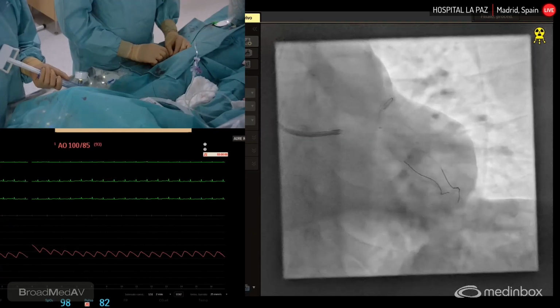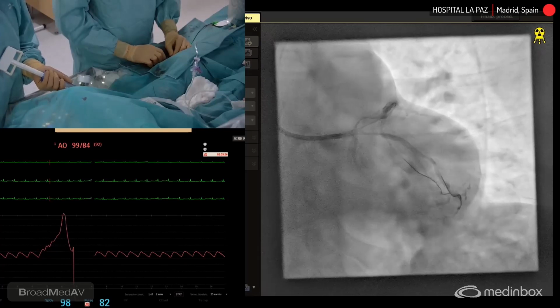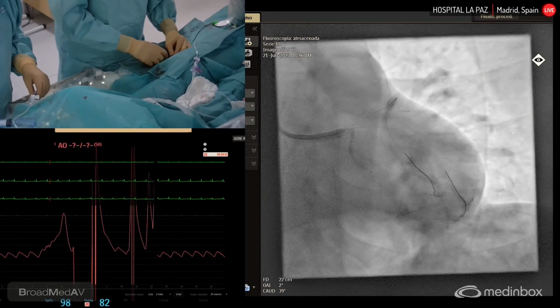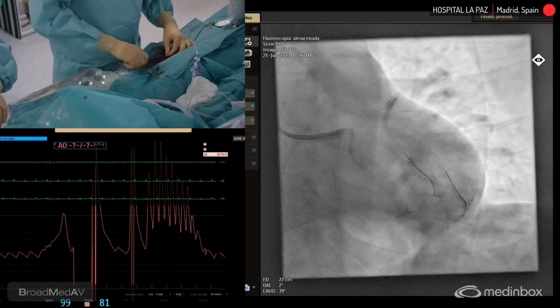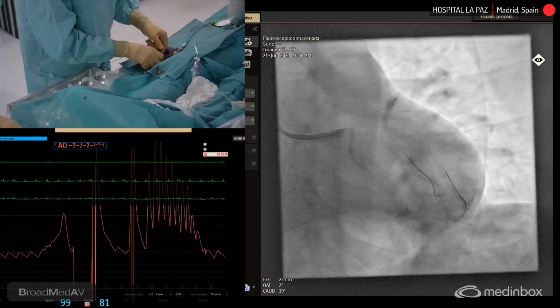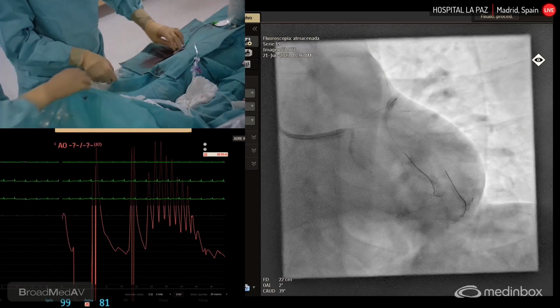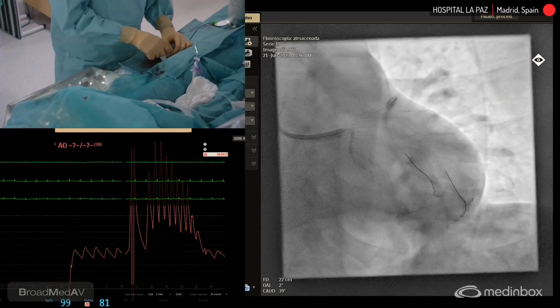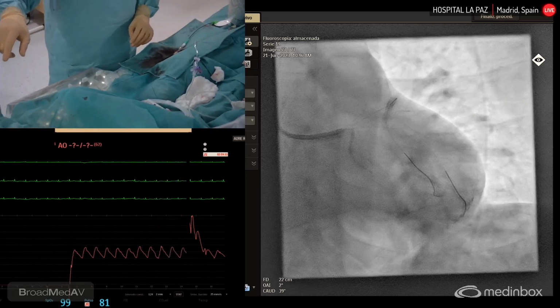No question, right, Borja? No. No question. Test pequeñín. Okay. Now everything seems worse because the stent is quite good. This is the best part of the vessel right now. We're going to administer nitroglycerin again and check with IVUS. Okay, nitro.